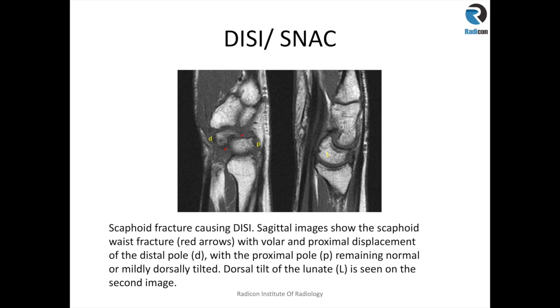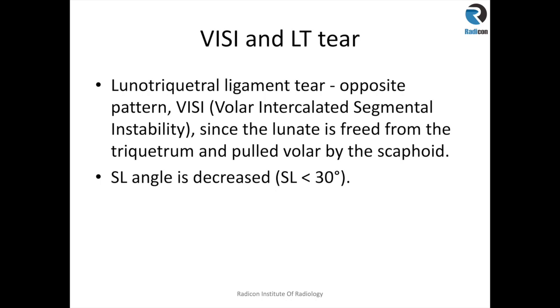Here is a case of SNAC wrist. There is a fracture through the scaphoid: the distal pole is displaced more towards the volar aspect, while the proximal pole remains attached to the lunate. Measuring the angle along the long axis of the proximal and distal poles of the scaphoid and through the lunate gives an increased scapholunate angle, consistent with SNAC wrist.